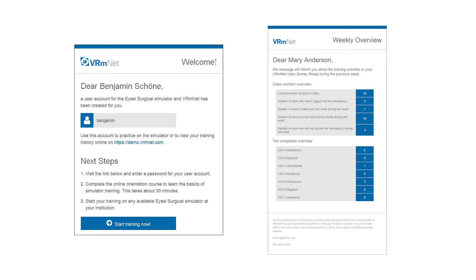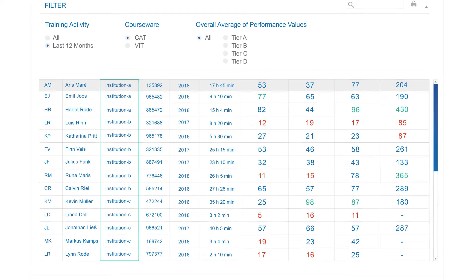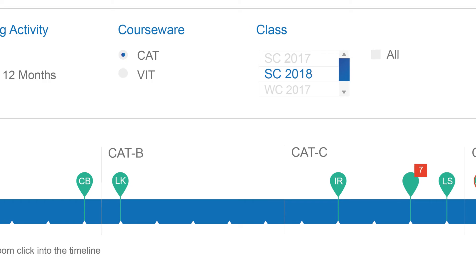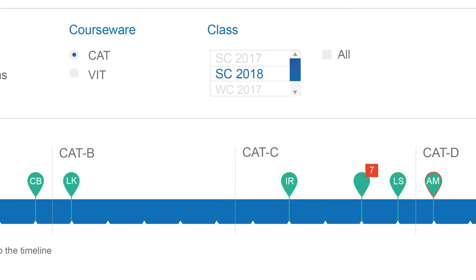Configurable notifications and reports keep educators informed on their students' progress. Training data can be analyzed online down to the last detail.